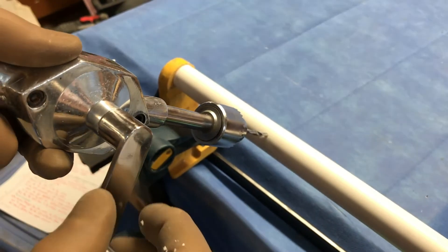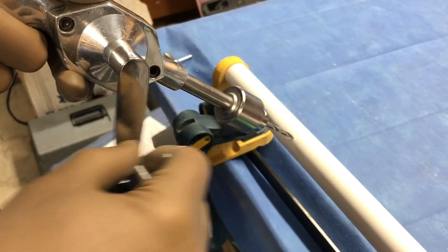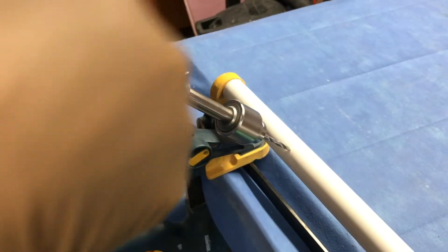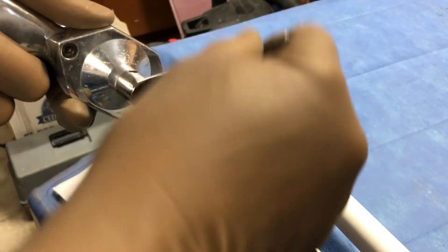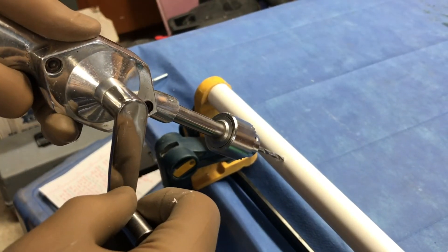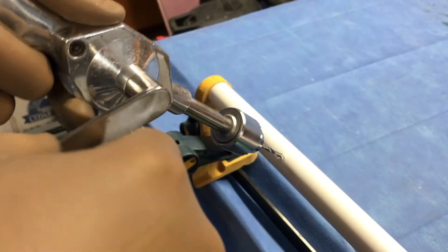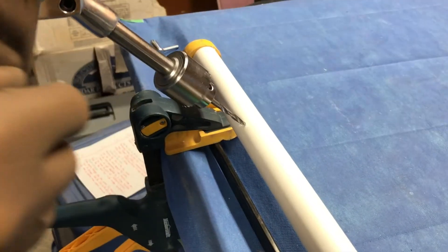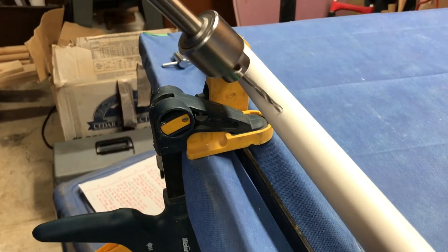Technical skill number three: drill at a slow and steady rate, not fast. This is approximately the rate of a count of one, two, three, four, five, six — about that rate. A slow and steady rate, and hold the drill bit steady. As you turn, it's very easy for the drill bit to move, and that will create an irregular hole and damage the bit. Hold the drill bit straight and steady.